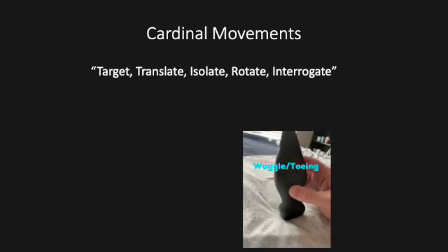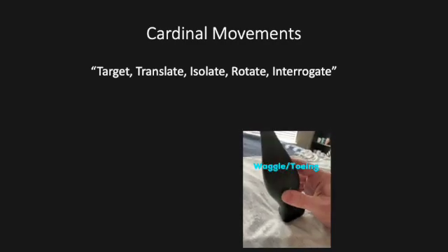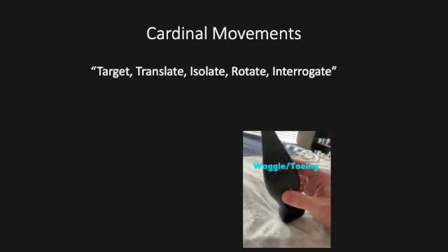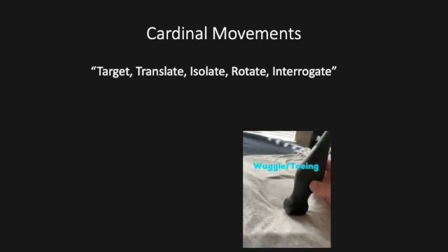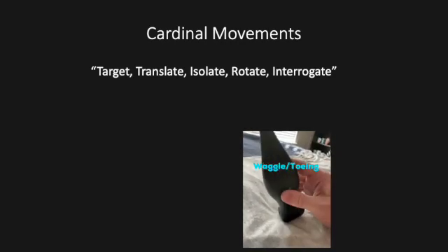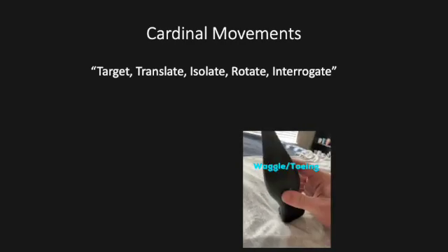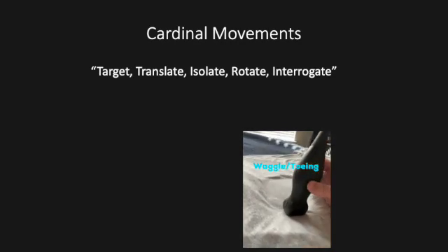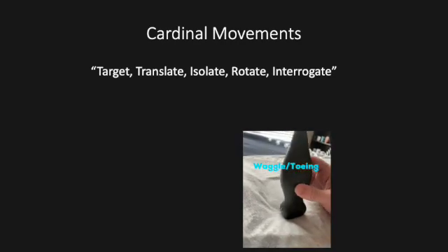So this is how, once we've gotten our footprint situated over the right portion of the patient, we need to adjust the angle of insonation by adjusting the beam, almost like a flashlight. We've got it in the right spot, but we need to curve it around to look at all the different angles. A good analogy for this is, imagine if you were doing some plumbing underneath a sink and that there wasn't great lighting in there.